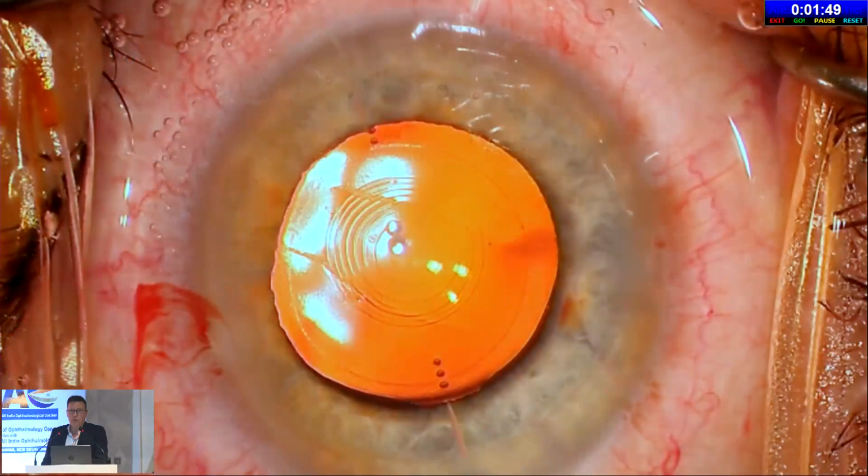It's of course important to put the lens in the right axis, and therefore I use two devices. First of all, you can see here the markings in the cornea, which is done by the femtosecond laser. And secondly, I work with a microscope, which gives me a digital overlay where to put the lens. When those two are matching, I'm pretty sure I put the lens in the right position.